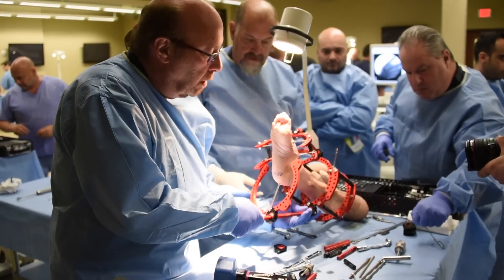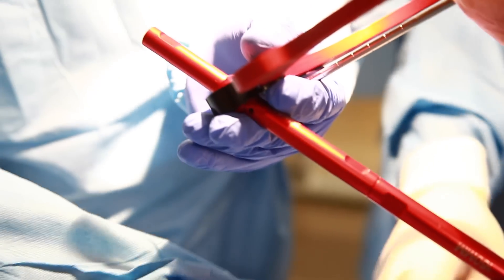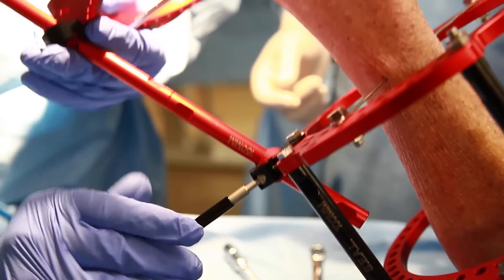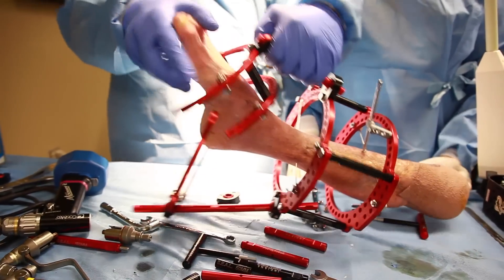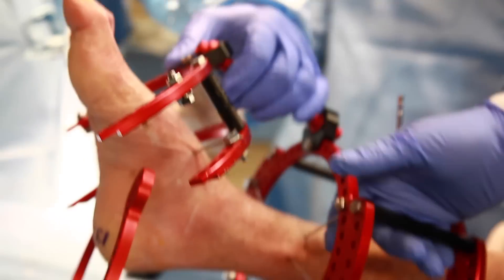I'm going to reduce it like this. I get it into position under fluoroscopy, get it where I want it, then tighten this down and tighten this one down here. Then a couple more struts for stability if needed — you'll put one here. This is completely stable. You can see the medial longitudinal arch of the foot is over-exaggerated and maintained.